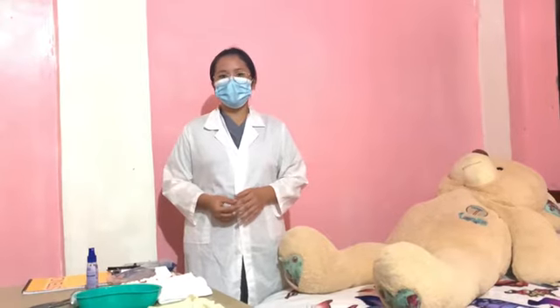And then, gather all the equipment and select the appropriate NG tube. So, here I've already gathered my equipment. Close the patient's bedside curtain or door. Raise the bed to a comfortable working position, usually elbow height of the caregiver. Assist the patient to a high Fowler's position, elevating the head of the bed to 45 degrees if the patient is unable to maintain an upright position.